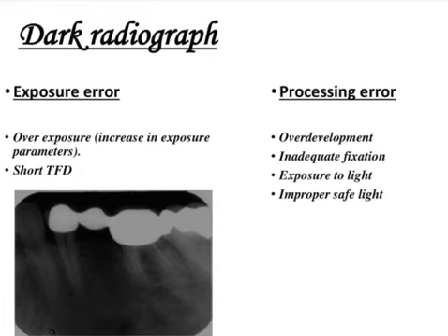So you peeled the film packet, opened it, and removed the film. You placed the coin on the film, waited 5 minutes, and then you started developing, rinsing, then fixing, and finally washing it. And when you dried it, you saw that there is an outline of the coin on the film.